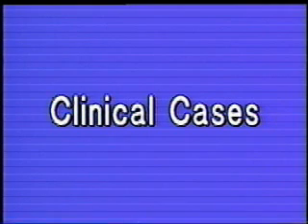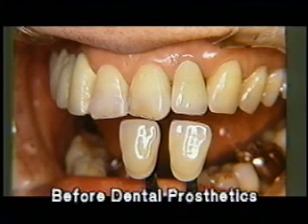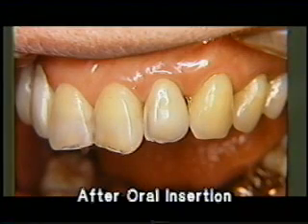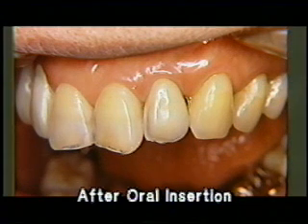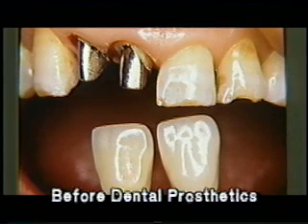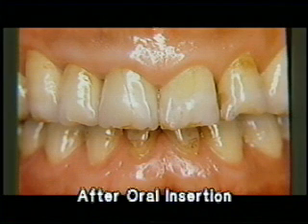Before we close, let's have a view of clinical cases with the application of the above technique. The left lateral incisor has been restored. The prosthetics well simulate the complicated color shades. Look at the right central incisor and lateral incisor. It shows exactly the configuration and color shade for a middle-aged person and match with the adjacent teeth.